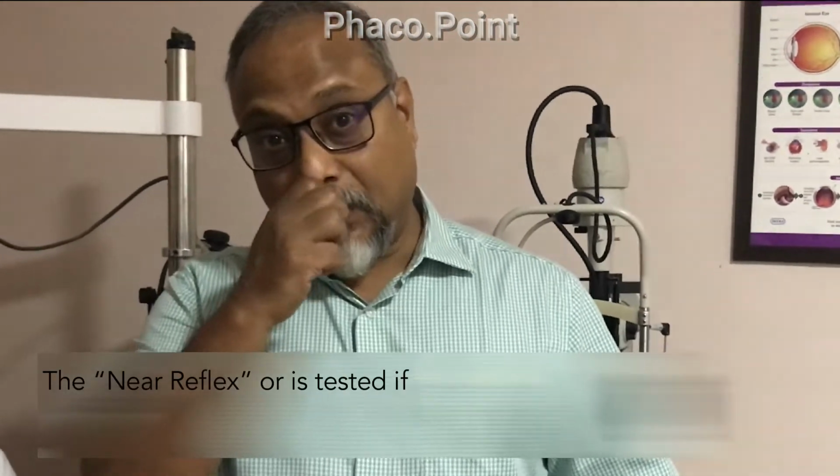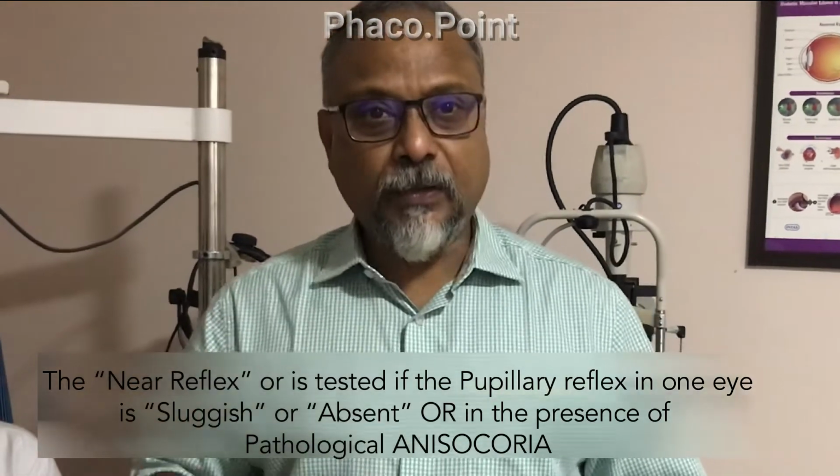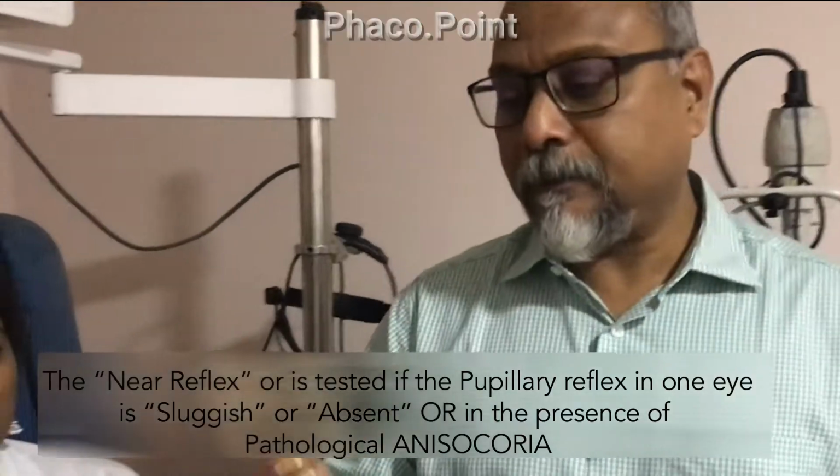Now suppose the person has a sluggish pupillary reflex, then you have to check the near reflex as well. Let me show you how to check the near reflex. For this, we need to use a stick which has got an accommodative target on it. So this test is performed by first explaining. When I ask you to look, you look at this. Otherwise you look straight. Okay? So now look straight.